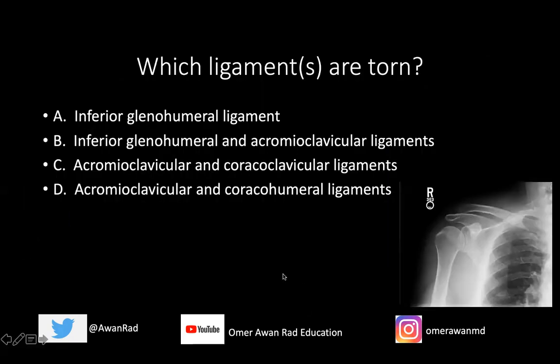The question I have for you is: which ligament or ligaments are torn? Is it the inferior glenohumeral ligament, the inferior glenohumeral and acromioclavicular ligaments, the acromioclavicular and coracoclavicular ligaments, or the acromioclavicular and coracohumeral ligaments?